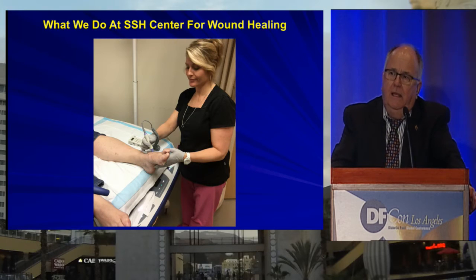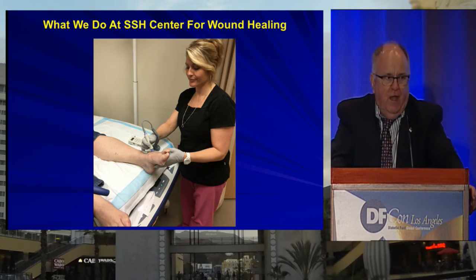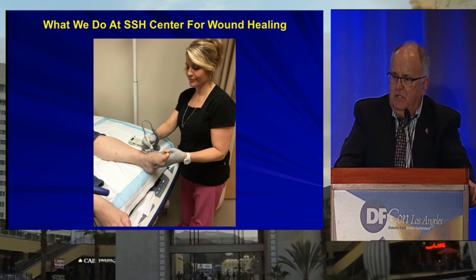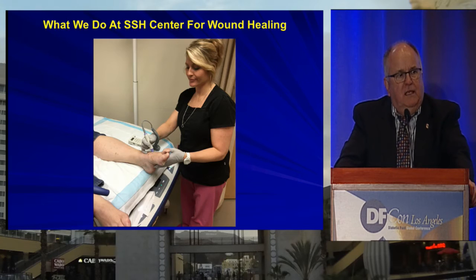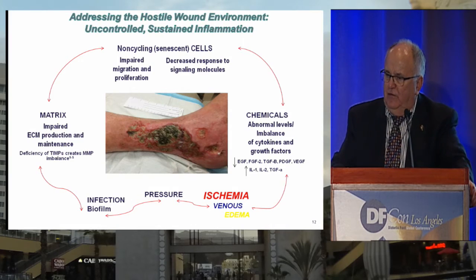But what I really want to get back to, and what we've done in our clinic, is that we have trained and certified all of our nurses to really do a good pulse exam, a good history. That's where you really can learn a lot about this. So you can see the neuropathy, you can see autonomic neuropathy, you can feel for the pulses, and then we use a handheld Doppler and evaluate for the quality, triphasic, biphasic, monophasic, and then do Doppler waveform analysis as well.